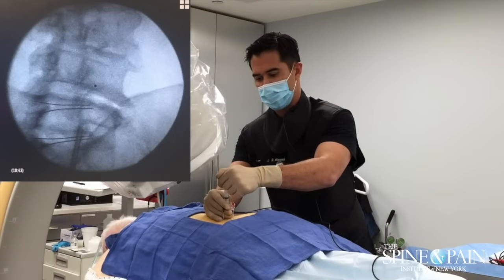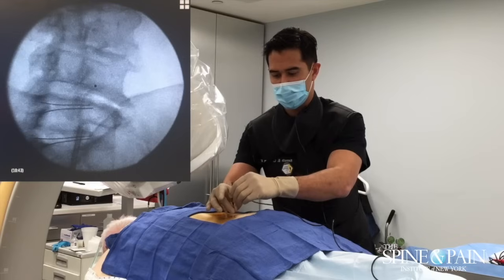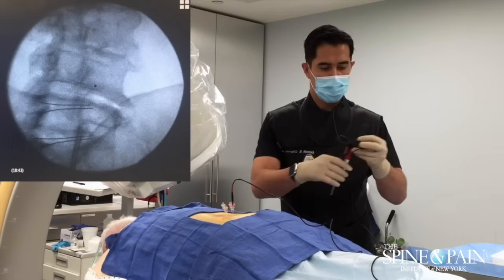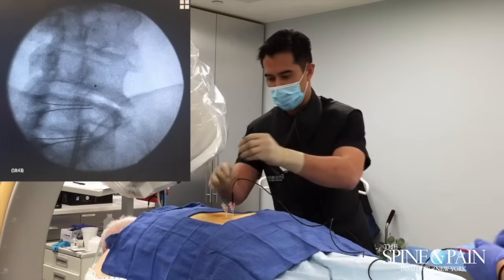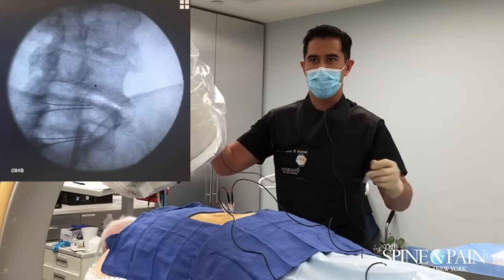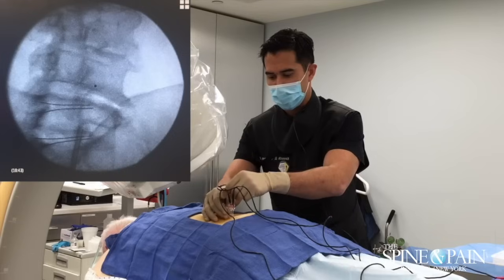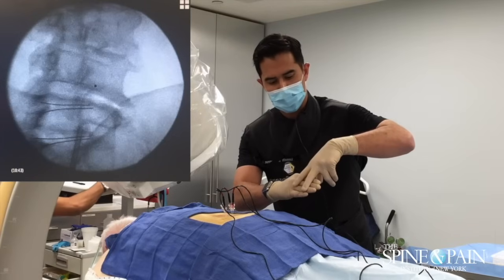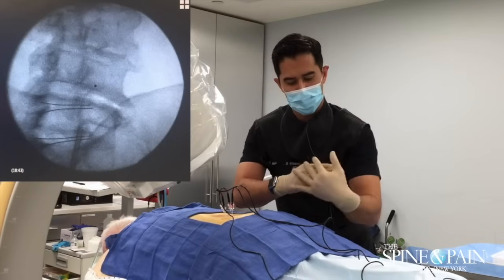A tiny bit of local anesthetic with steroids — that takes about five minutes or so to take effect. Now I'm connecting these electrodes at the tip of the needle. There's a one-centimeter area at the tip that heats up and creates the thermal lesion. You can see we have about one centimeter. The reason we go to this oblique view is because the active tip is on the bone — shaped like this — so we're creating a lesion around where these nerves come up.